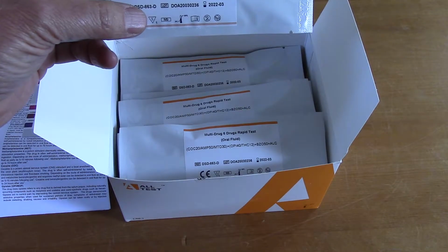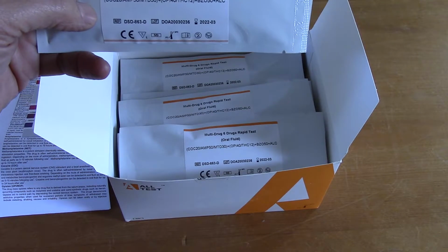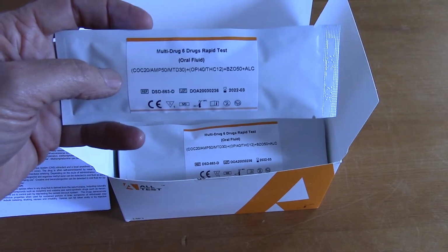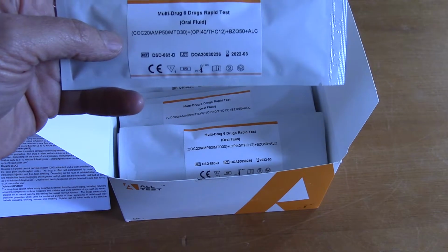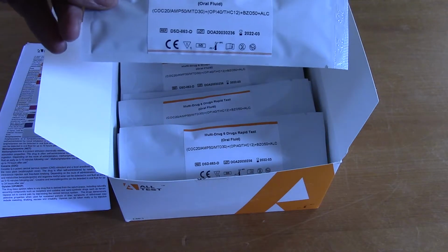These have been put in 863 foils. This will be changed to 873 because this is a combination 6 drug plus alcohol test. If we just run you through the combination that you get on here: cocaine, amphetamine, methadone, opiates, cannabis, benzodiazepines, and the alcohol pad.